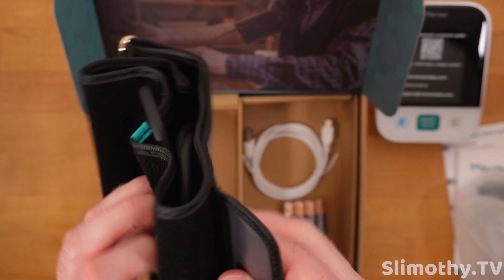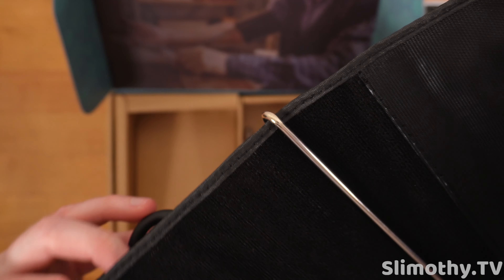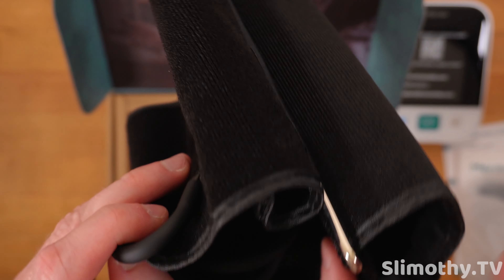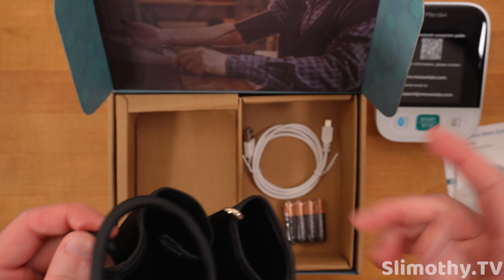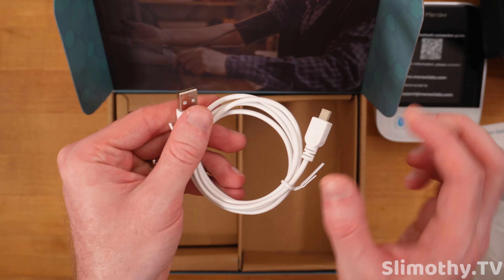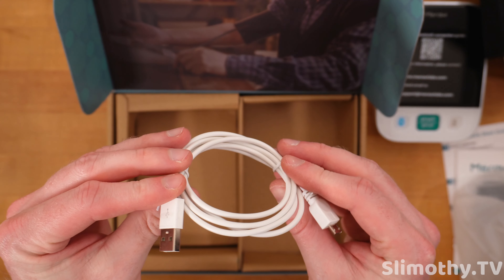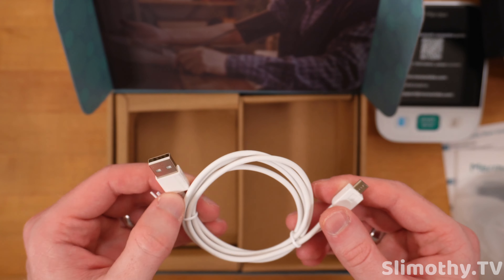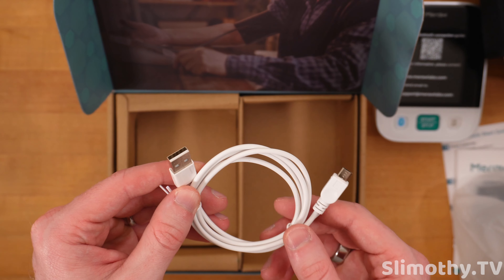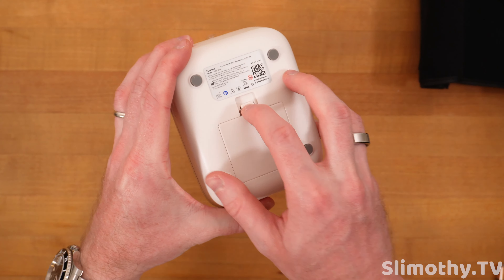This feels very high quality — honestly medical grade, which is kind of crazy. Here is the little tube that plugs in, and it comes with Duracell batteries. The charging cable is USB-A to micro USB — that's a no-no in 2024. It's going to get the job done, but this needs to be USB-C to USB-C, or at least USB-A to USB-C.